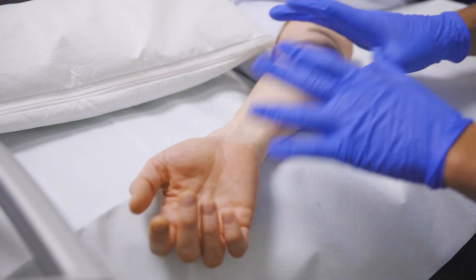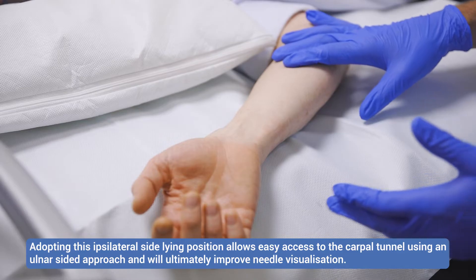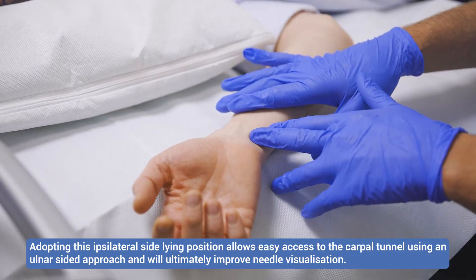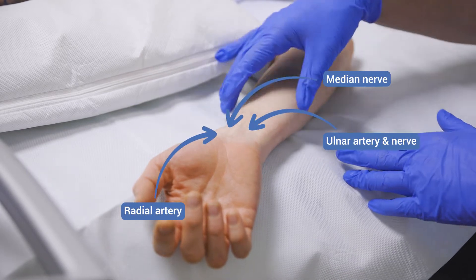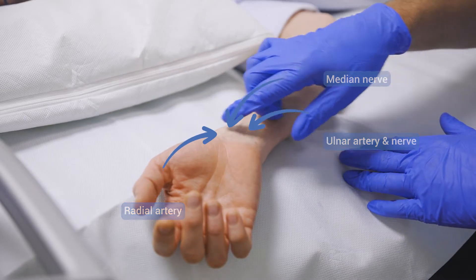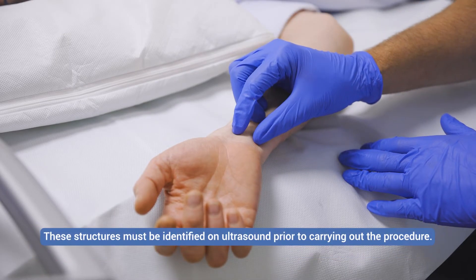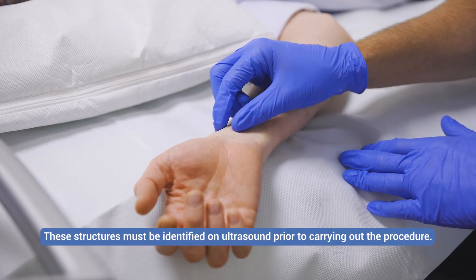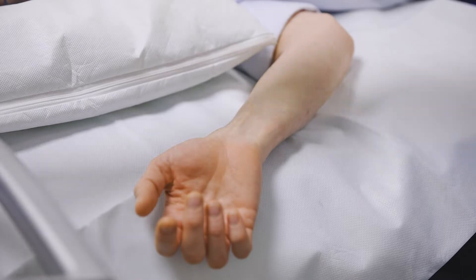Like with all of these videos, the first thing you need is some ultrasound skills and the ability to identify the relevant ultrasound anatomy. I generally carry out the ultrasound scan with the patient in this position because they are nice and relaxed. It also allows us to come from the ulnar side. One of the most important things before carrying out a median nerve injection is to find the ulnar artery and radial artery. Normally the distance from the median nerve to the ulnar artery is longer on that side, making it a nice access point, but it does vary so you must check on everybody.